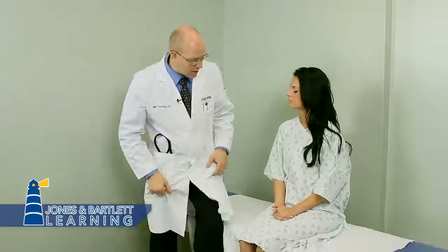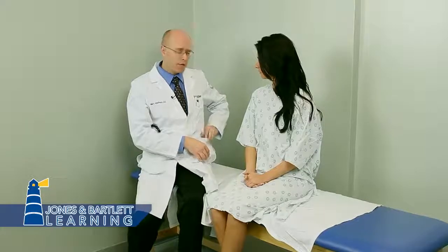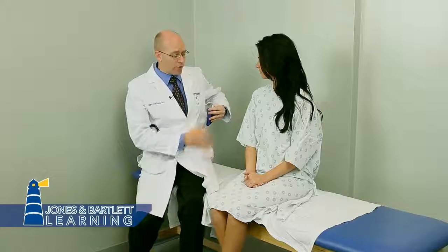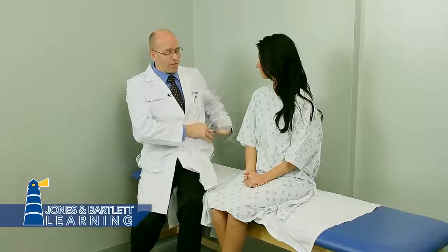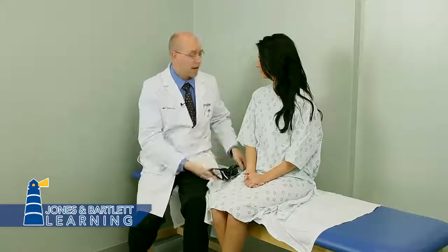So what you do at this point is sit beside the patient. Patients won't intentionally try to change their respiratory patterns, but they will accidentally do so. So I always use a combination technique where I'm checking for the pulse and the respirations at the same time, actually respirations first, and then following that by pulse. Getting my equipment out and ready.